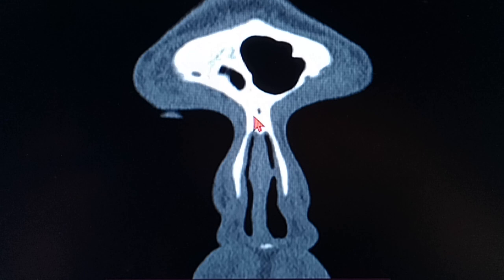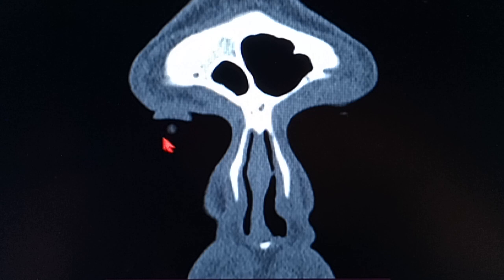I'm going behind. You can actually see a part of the right eyeball coming into the picture right now. Still, that's the frontal process of the maxilla. That's the nasal septal cartilage. No perpendicular plate of the ethmoid visible. And you can start seeing the right side frontal sinus, which, as compared to the left, is pretty small. That's the frontal beak area. Still, that's the frontal bone. We do not see brain as of yet. And you can see a small bony shadow over here. That is a bright area that could represent the maxillary bone, on which the nasal septum is attached, the maxillary crest mostly.